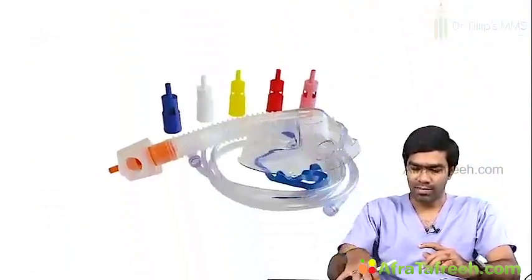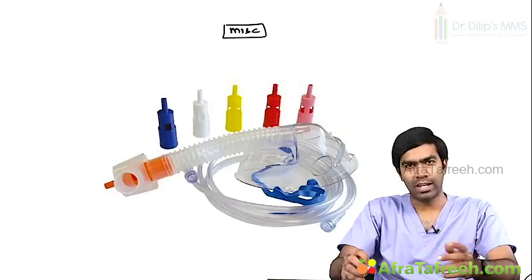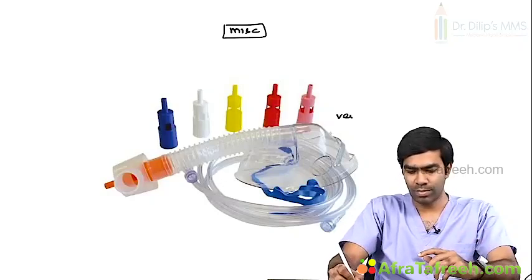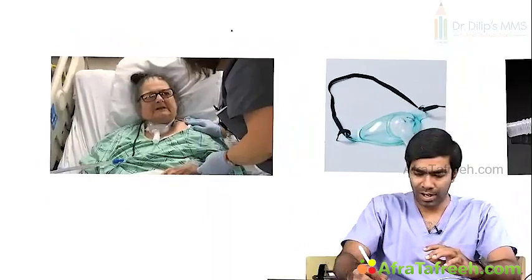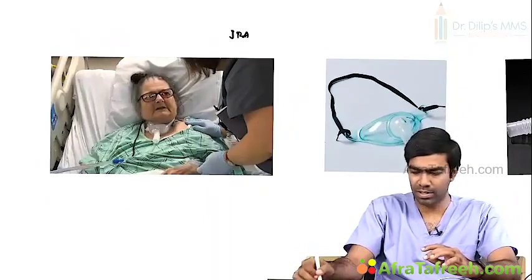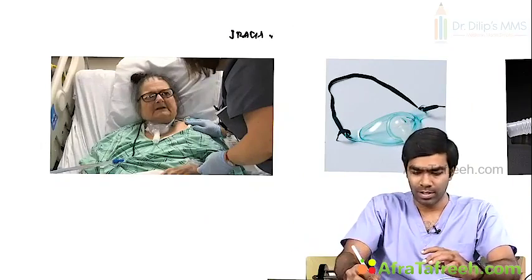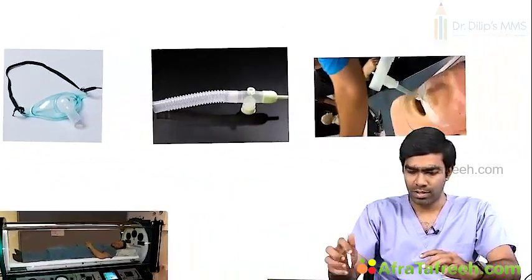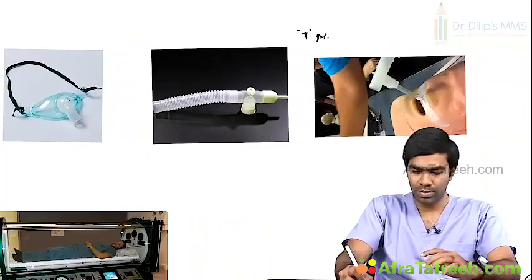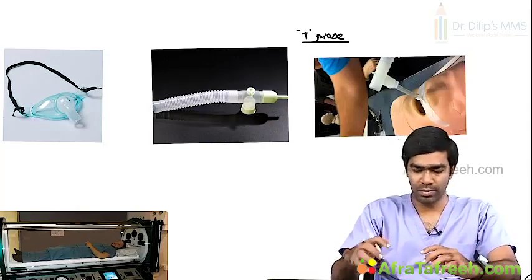And then we have miscellaneous devices also, which are very rarely and sparingly used. One is the Venturi mask. Again, we have a lot of discussion left on the Venturi mask. And we have the tracheal mask also. This is like a simple face mask, but it's suited to be kept over the trachea in patients with tracheostomy. These are called trach masks or tracheal masks. Then you have T-pieces, very commonly used, especially when you are weaning from a ventilator.